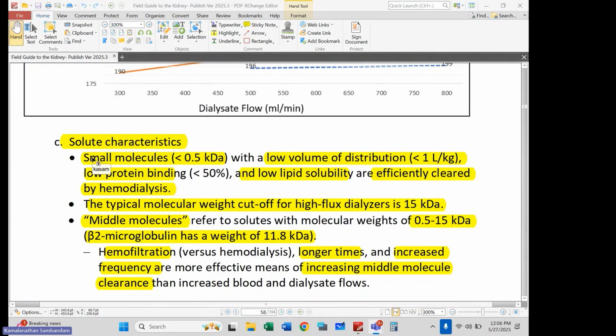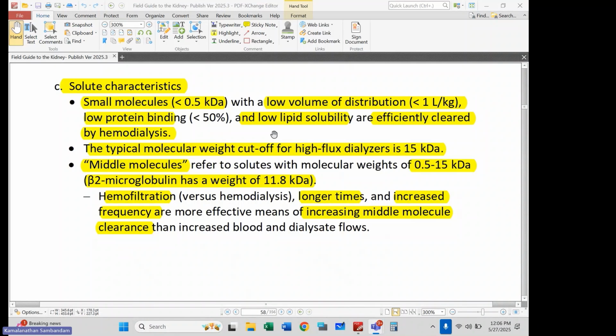Let me clarify one misstatement that I said, quoting the molecular weight of myoglobin. I overestimated it. It's around about 20 kilodaltons. Again, albumin, I stated correctly, was around 70 kilodaltons. So keep that in mind as you're assessing the capacity for clearance. That molecular weight of a solute is a major determinant of clearance.